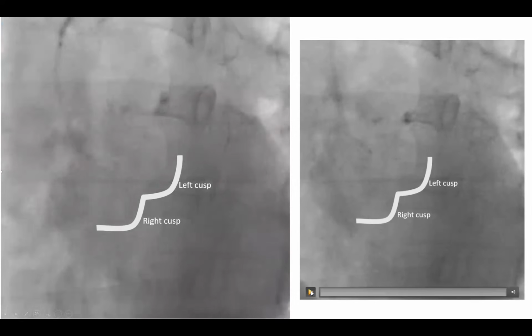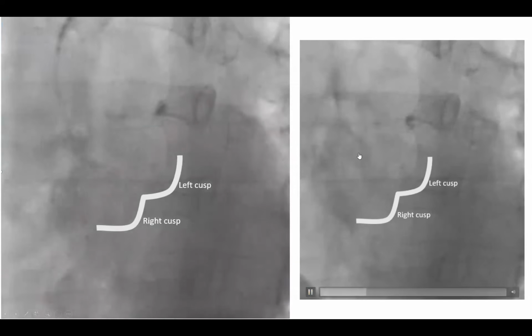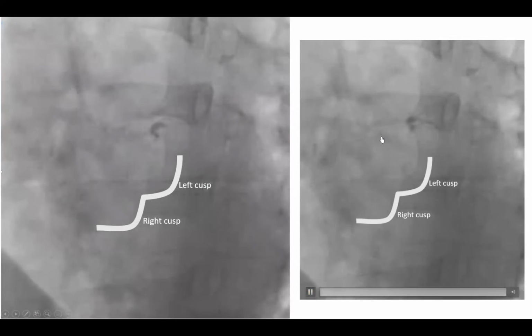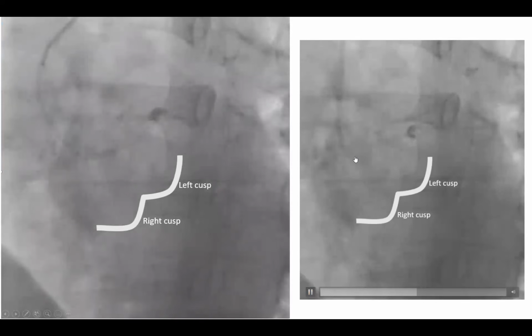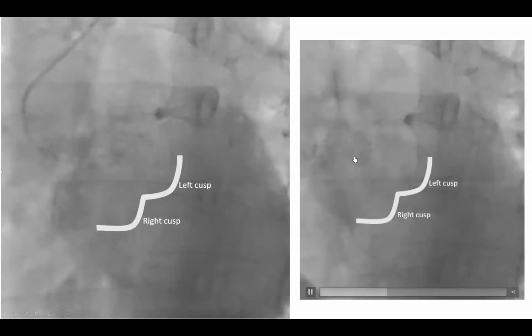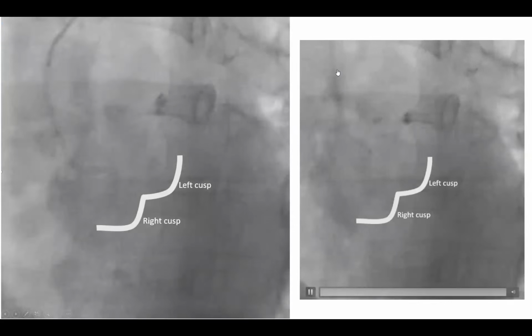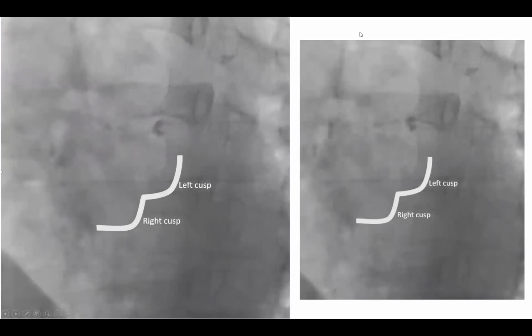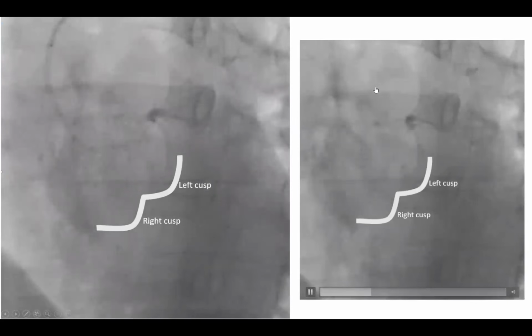I want to highlight in the image on the right here, again, that key moment where experience comes in. This here, watch it. The catheter was about to fly out. We immediately reverse torque. That was a key moment. So if as I was pulling, I had a slight clockwise torsion on it, I will immediately counterclockwise to reverse it and prevent that outcome, okay? And get it into the left cusp rather than get it back up into the ascending aorta or the aortic arch. You got it? This is the key moment in every engagement.